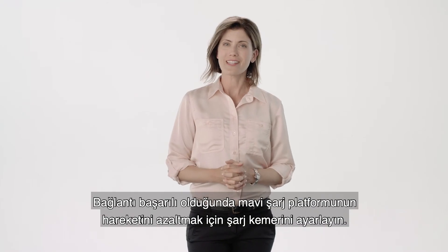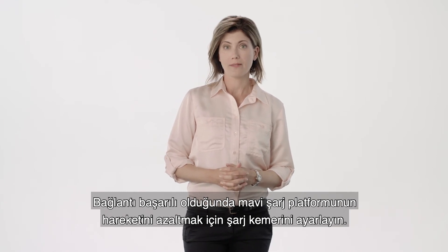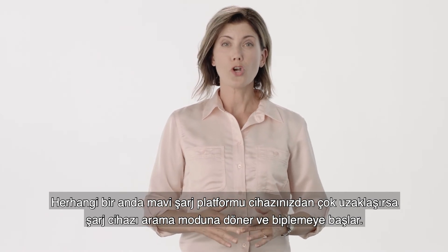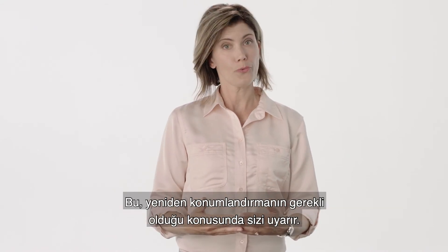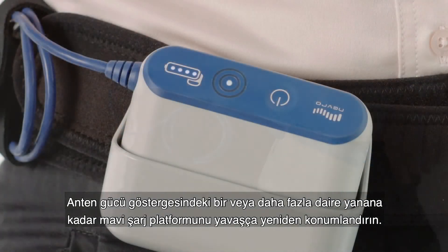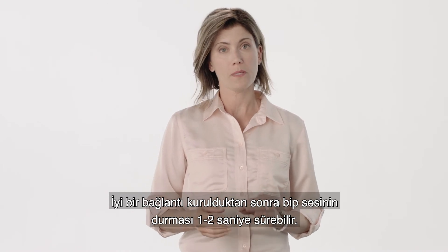Once connection is successful, adjust the charging belt to reduce movement of the blue charging pad. If at any point the blue charging pad moves too far away from your device, the charger will return to search mode and will begin beeping. This will alert you that repositioning is needed. Slowly reposition the blue charging pad until one or more circles on the antenna strength indicator are illuminated. Once a good connection is made, it may take one to two seconds for the beeping to stop.